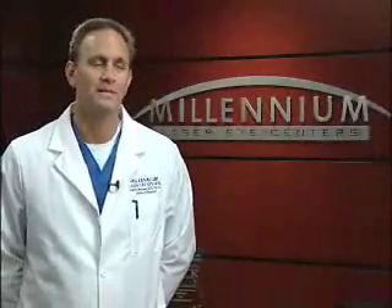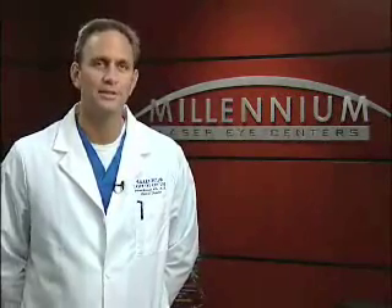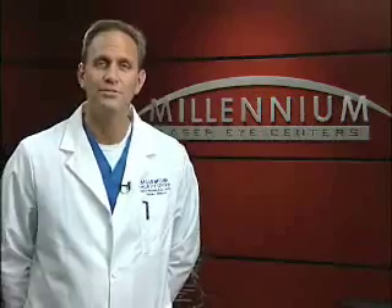Hi, I'm Dr. Andrew Holzman of Millennium Laser Eye Centers, now a TLC Laser Eye Center partner, and I'd like to thank you for choosing us for your laser vision correction procedure. I'm in my surgical scrubs because I'm about to do another eye procedure, and I'd like to invite you along as I prepare our next patient for the surgery.